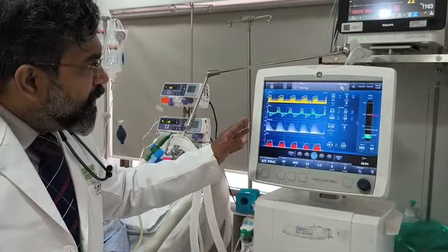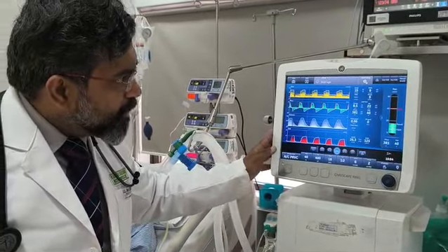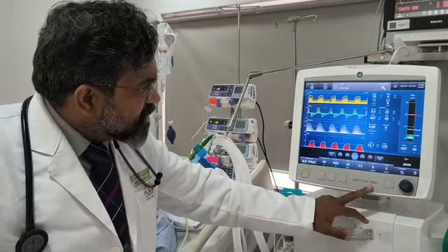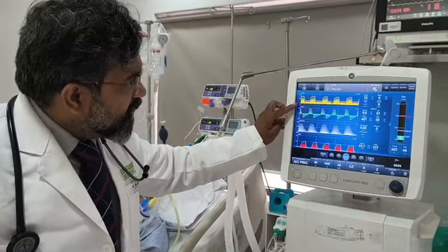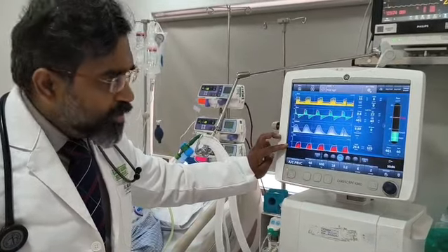Here is a patient who's been ventilated for sepsis and septic shock. He's on high inotropic support. Now we are seeing the CareScape R860 showing us the pressure time scalar, the flow time scalar, the volume time scalar, and the ETCO2.